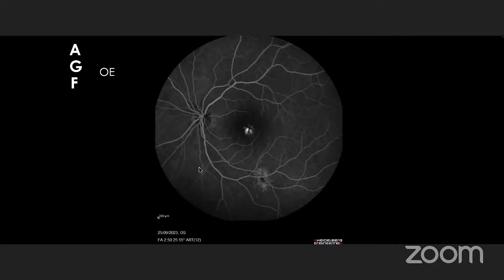Então, essa lesão periférica atrófica, né? Porque eu acho que tem relação com o quadro de aqui inferior à papila, parece ser fora da arcada. Então, por classificação, você poderia associar com o MFC e não com PIC, né? Mas eu acho que é uma membrana inflamatória, não relacionada à alta miopia, né?